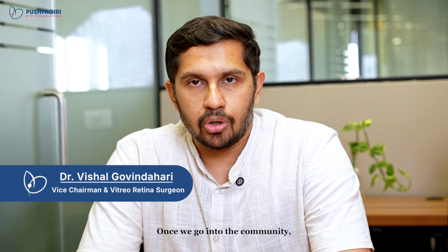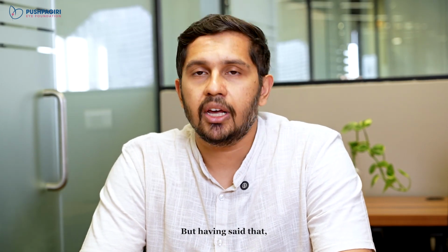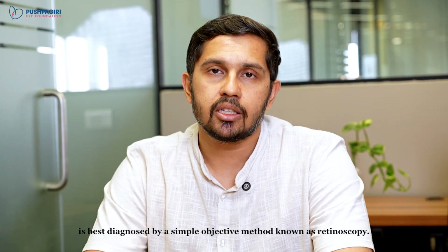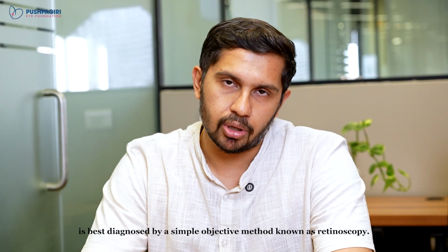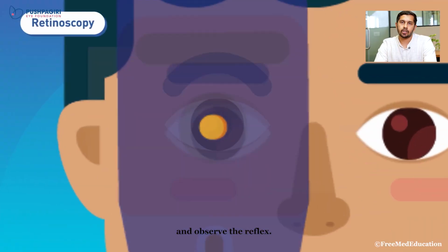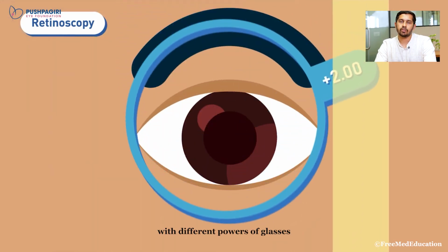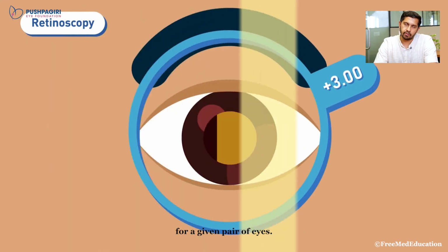Once we go into the community, we are often limited by the amount of imaging we have available. But having said that, hyperopia in general, be it in the community or in the clinic, is best diagnosed by a simple objective method known as retinoscopy. In retinoscopy, we shine a light into the eye of the patient and observe the reflex. Based on this reflex, we neutralize it with different powers of glasses and hence determine what is the correct correction for a given pair of eyes.